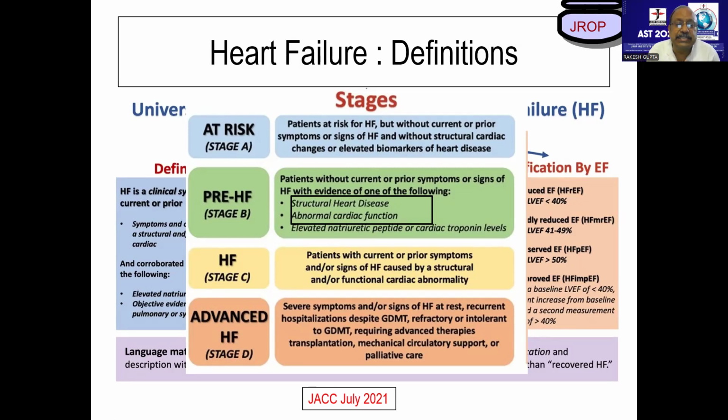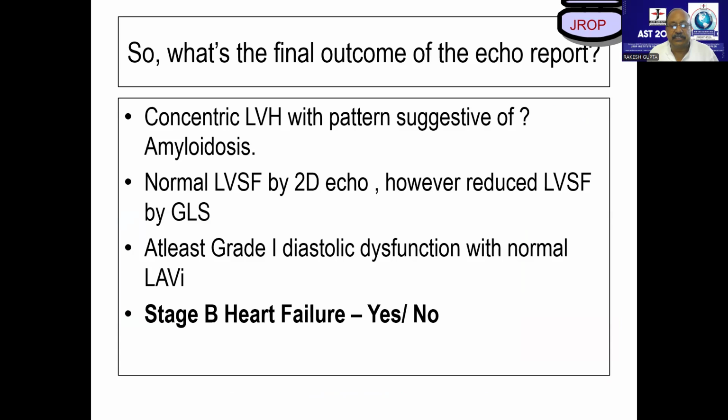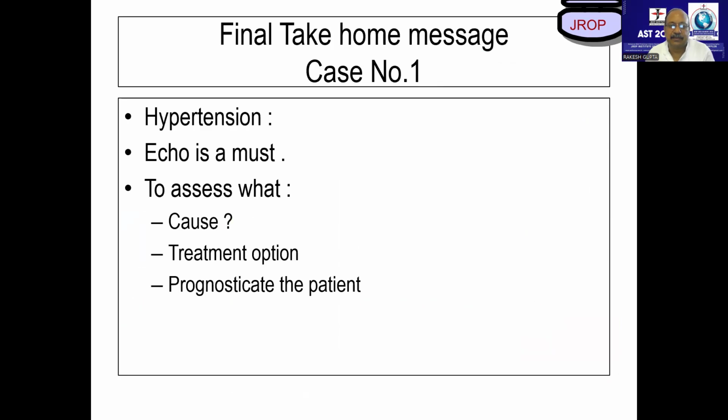So our patient, the same patient which we evaluated truly by echocardiography, is in stage B heart failure. And that is the time to react. If you leave him, he's going to go into stage C heart failure very quickly. Just simple echo. So I always say, do this echo, it makes a lot of difference. And if you do not treat this patient at this stage, believe my words, he'll go to stage C heart failure.